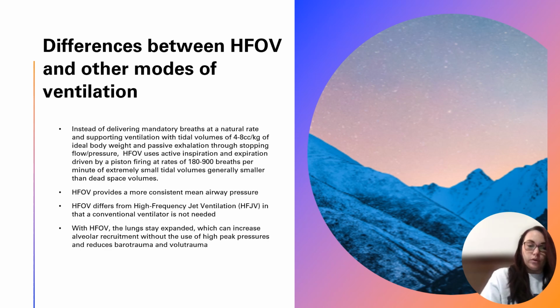With this mode, your lungs stay expanded, which increases alveolar recruitment without the use of high peak pressures, and this helps reduce volutrauma and barotrauma.